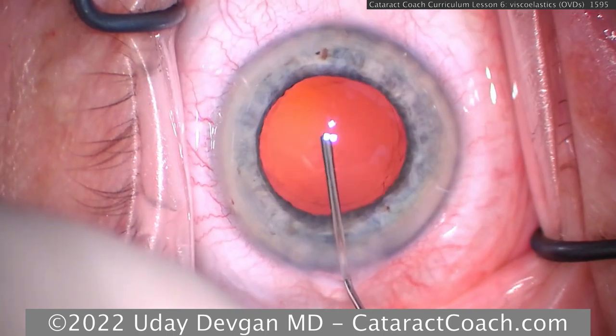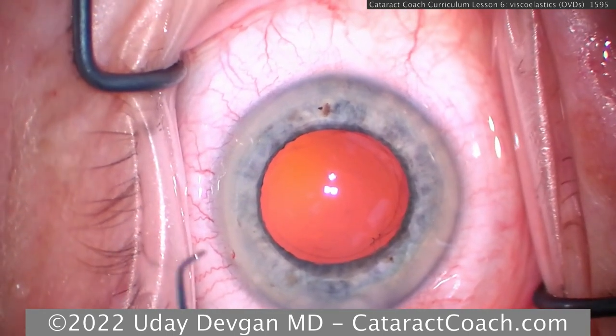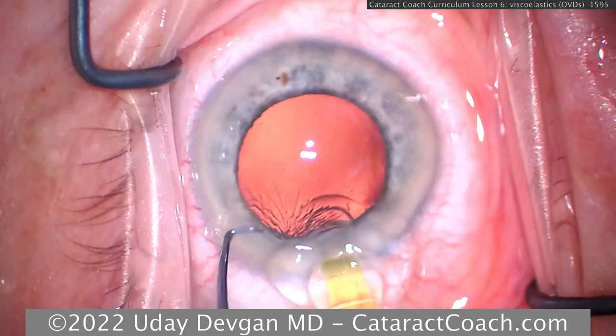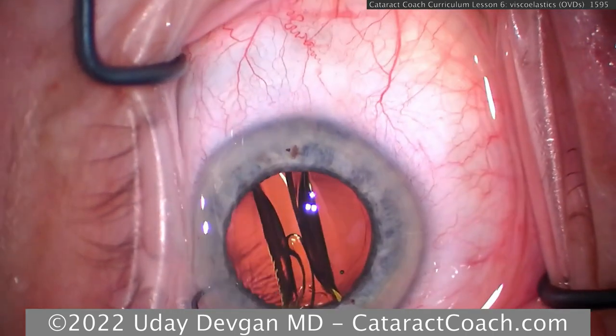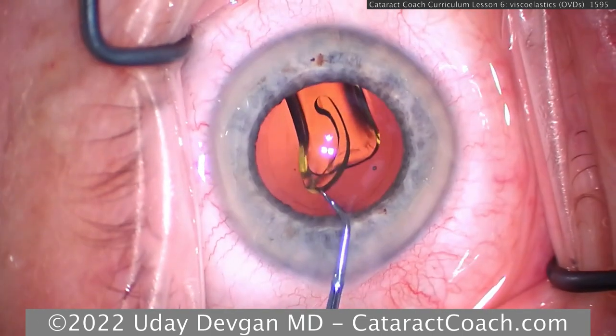Capsular bag is empty. We'll fill it up with a cohesive viscoelastic. And now we'll inject our IOL into the capsular bag. And we've all done this maneuver, of course, many, many times during routine cataract surgery. But when we put this IOL in the capsular bag, this optic is going to trap some viscoelastic behind it.